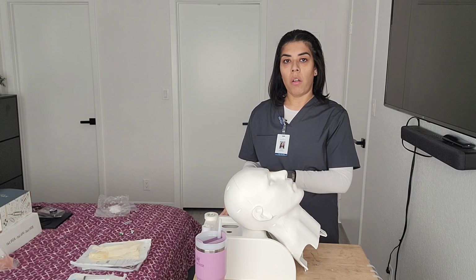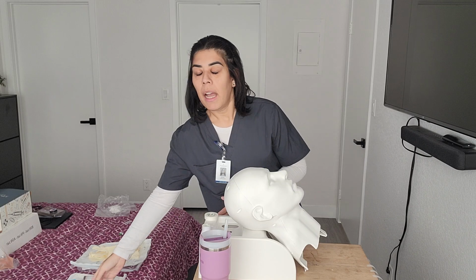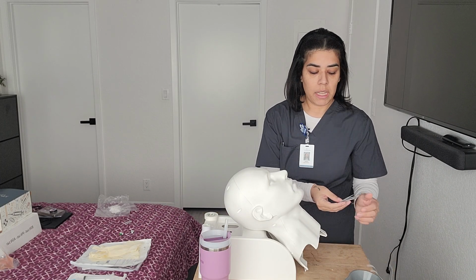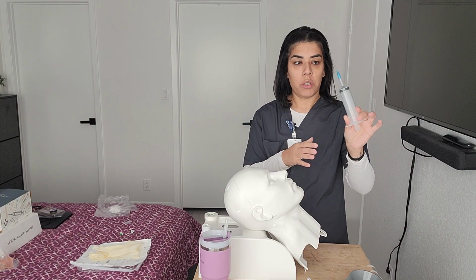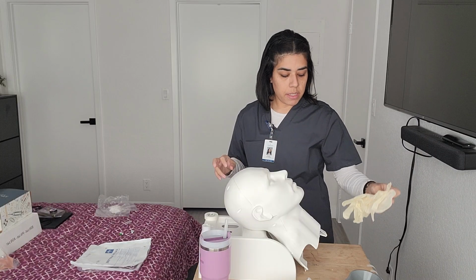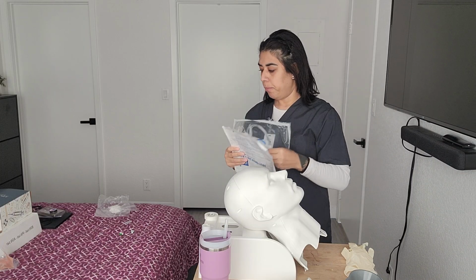So I have all my items with me as well. We have a cup with a straw for the patient. I have an emesis bin along with the lubricating jelly. We have a napkin for the patient along with the syringe. We have our gloves, and we have the NG tube here.